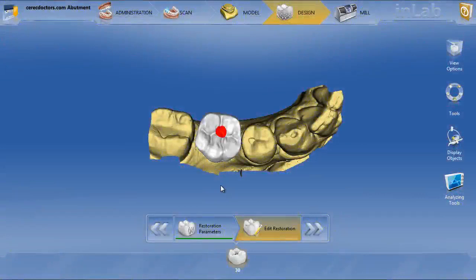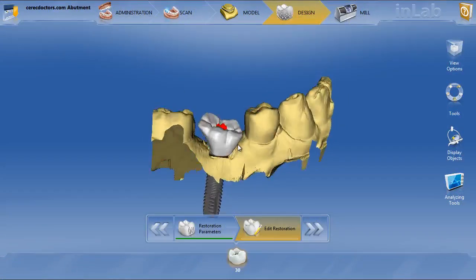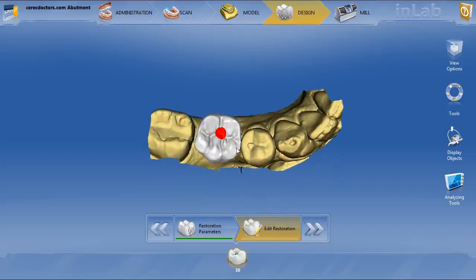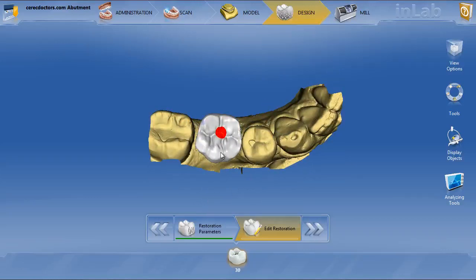Okay, this was an implant abutment on tooth number 30 that was sent in by a dentist just to have me evaluate why exactly he got such a poor proposal. This is actually before it was split into an abutment, just the original biogeneric proposal, and it's pretty bad. And judging by just the anatomy, I can tell that he had his biogeneric turned off.